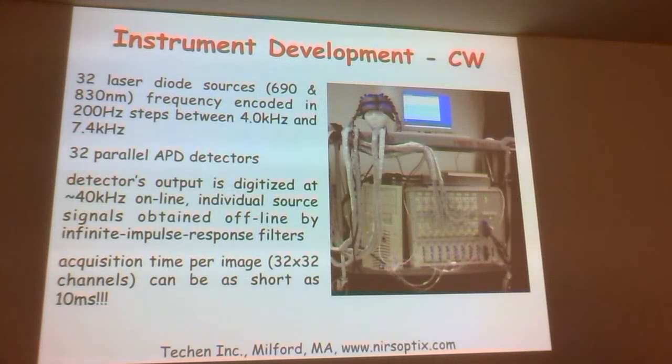right? Which is why I was mentioning the random walk length at the very beginning. With these NIRS measurements, we're only sensitive to that random walk length, right? That's the distance a photon typically travels before its direction is randomized. And that's exactly what that similarity relation shows. As I make g higher, so scattering is more anisotropic, more forward directed typically, I need many more scattering events for the direction to be randomized. But if I make the scattering length much shorter, then I end up with the same random walk length.